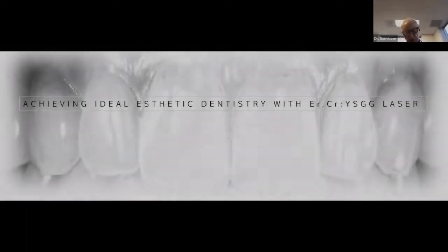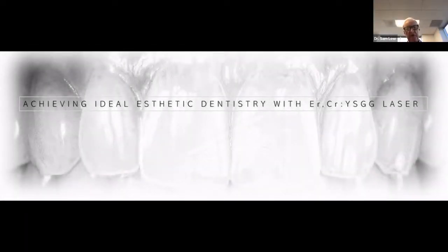Us to have this webinar with two very well-known prosthodontists. In the past, our webinars in the perio sector have been primarily around periodontitis, implantitis, and we'll continue with those arenas. However, there is a significant indication for using the erbium chromium YSGG because it is an all-tissue laser and is for both bone and for soft tissue.